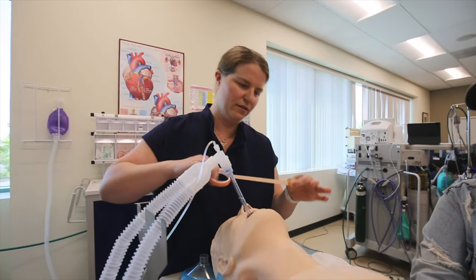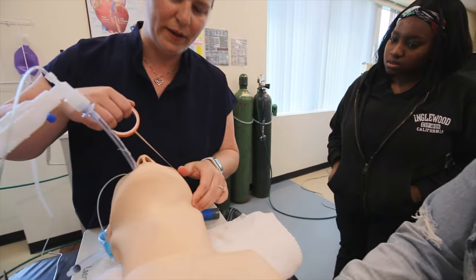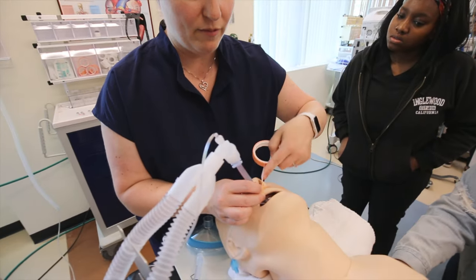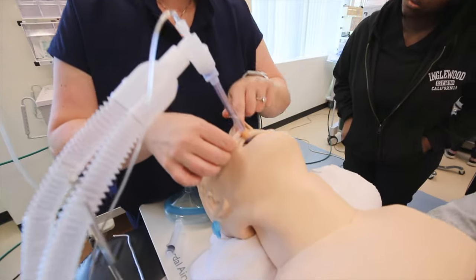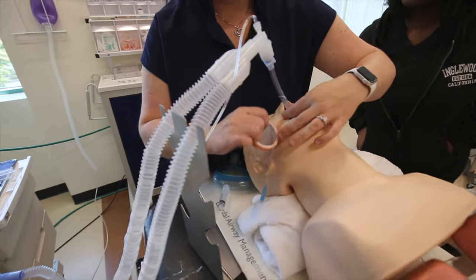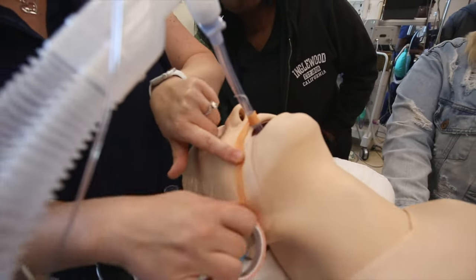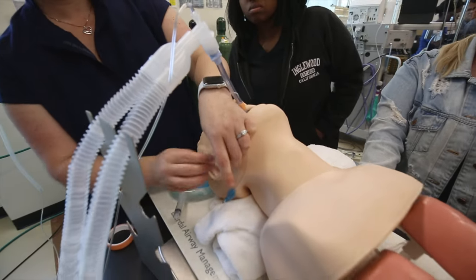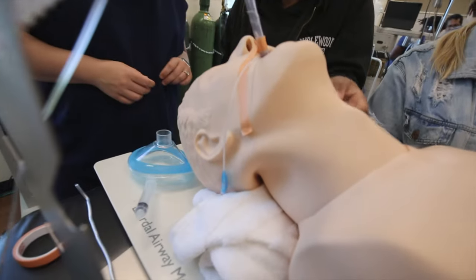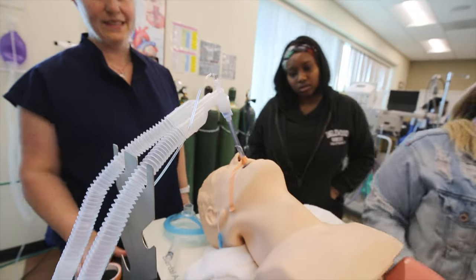To tape the tube, have a tab on the end. You're going to start at the left side and the lower angle of the mandible. Make a mustache so you're not taping on the lip itself. And then you keep the tape very close to the lip to avoid making any tenting here. Don't pinch the lip. The second loop, and then cinch it down there to, again, avoid any tenting. So this would be the weakest part of the whole thing. And then bring it back down to the right side, that lower angle of the mandible. Another little tab, and you're good. You have these tabs so you don't have to dig into somebody's skin to get the tape up. That's it.